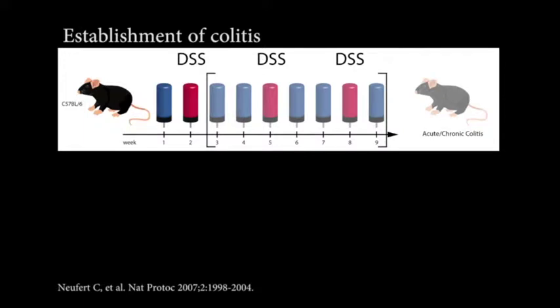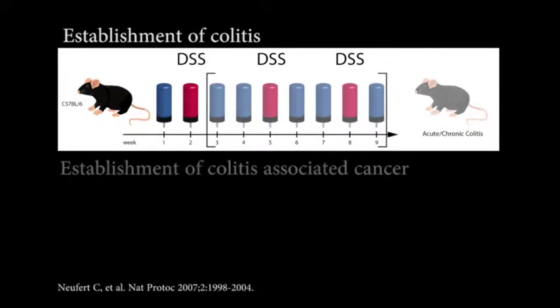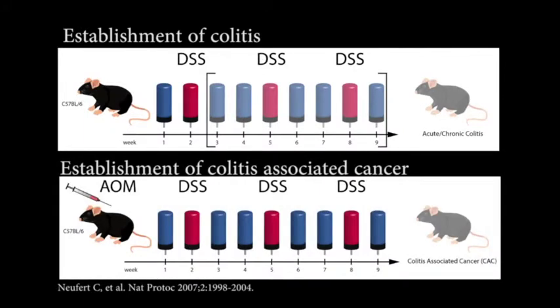We used RSOM to image murine colitis and murine colitis-associated cancer. For this, we used well-established models of colitis using dextran sodium sulfate or a combination of azoxymethane and DSS to induce colonic tumors.